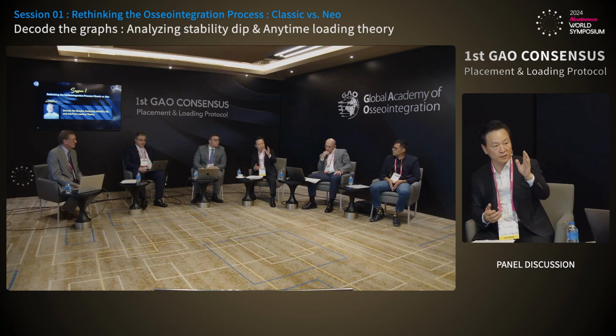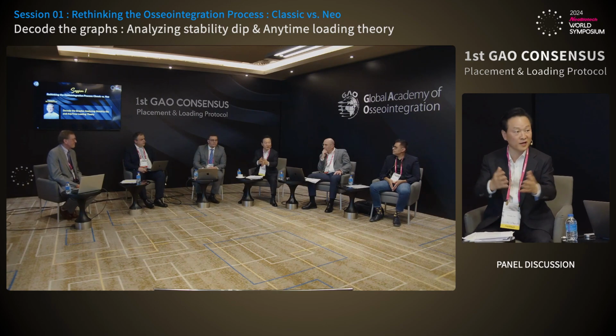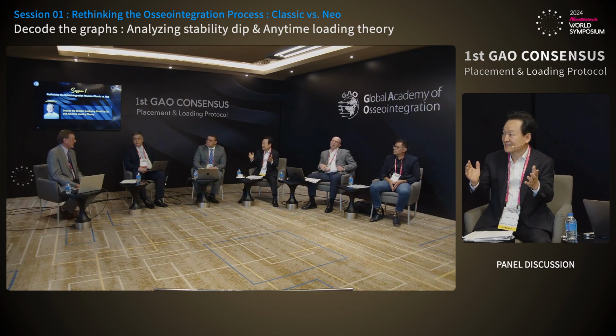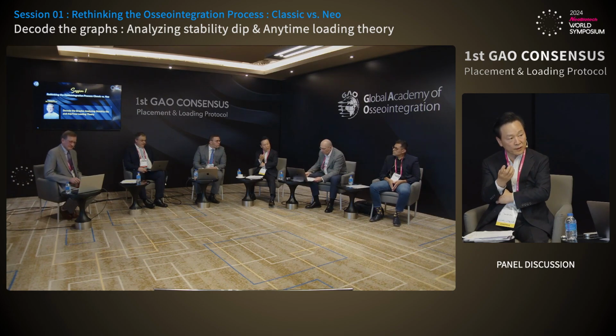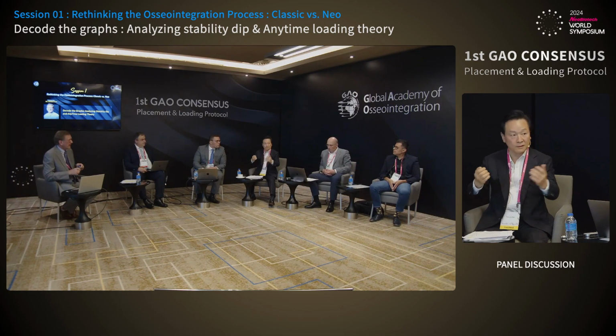Immediate loading is like that, but early loading is a different story, right? After 1 week, up to 2 months, nobody wants to touch the implant, right? Fear. Why? Because we don't want to get failure. We're afraid of failure, but we're also afraid of success. So we have to overcome that when we're talking about anytime loading. Anytime loading means including immediate loading and early loading. We want to touch the implants at any time: 2 weeks, 3 weeks, 4 weeks, any time.